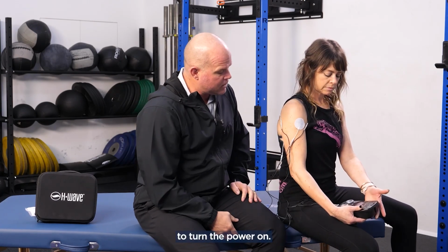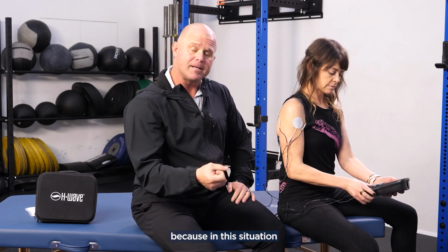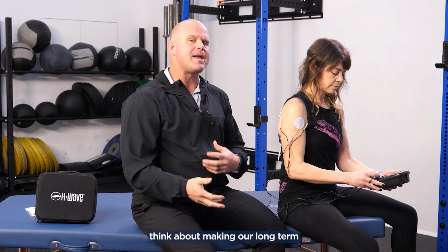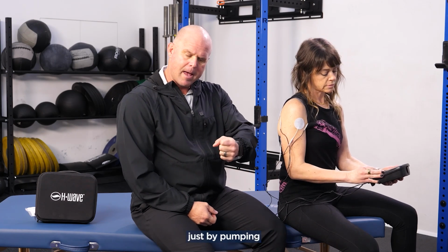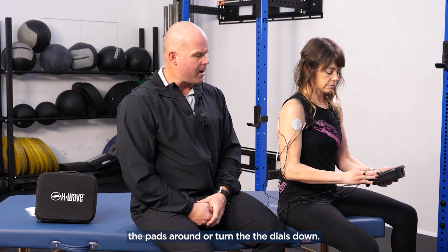Now we're going to instruct Lisa to turn the power on. She's going to go to low frequency on both settings, because in this situation we're trying to get movement and we're trying to decongest, which is really where we're going to make our long-term gains here. And then she's just going to turn this up and get comfortable. What we're looking for is never a contraction that causes discomfort. So if I'm getting a muscle contraction just by pumping and it hurts a little bit, move the pads around or turn the dials down.